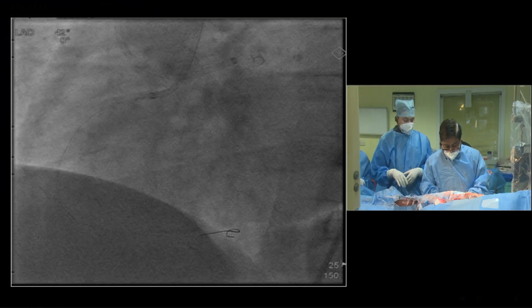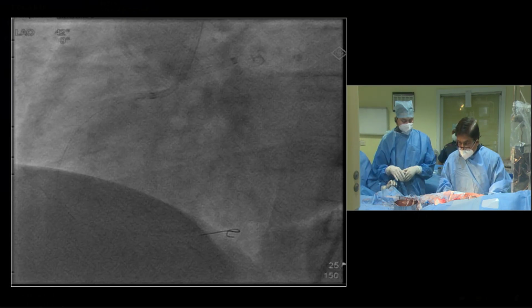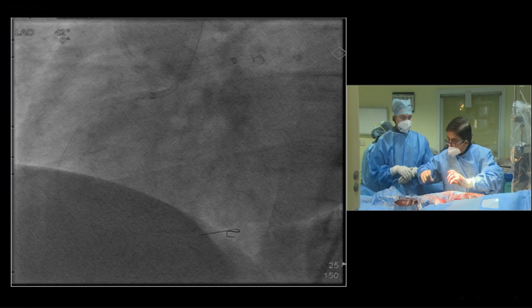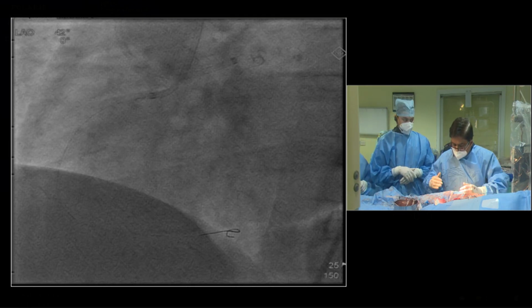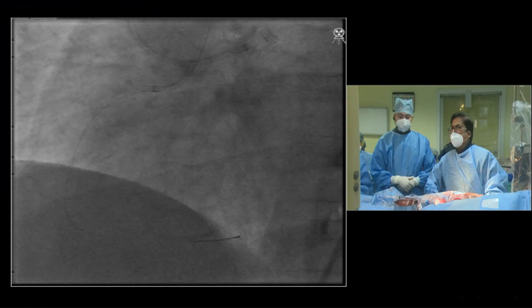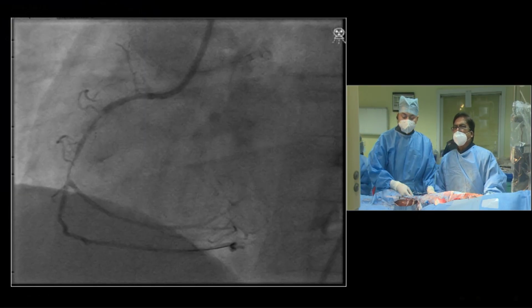But still, I use that technique sometimes when I have to leave a distal lesion on balloon only. And even otherwise, if you give a little longer inflation and deflate it slowly rather than releasing it suddenly, what happens is that immediate release can suck out the wall and produce a dissection. So if you release it slowly, whatever you've done tacks up and gives you a better result. I think with the DEB balloon, we're bringing back those techniques again. So when you're using your DEB, you're back to those old techniques of prolonged balloon inflations.